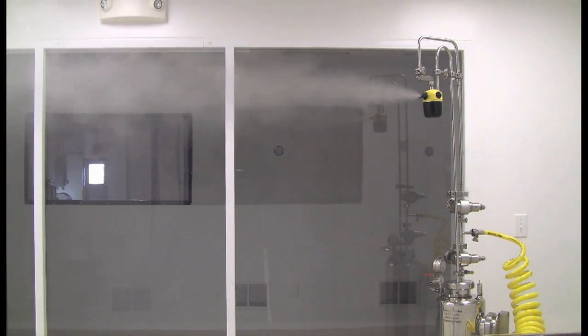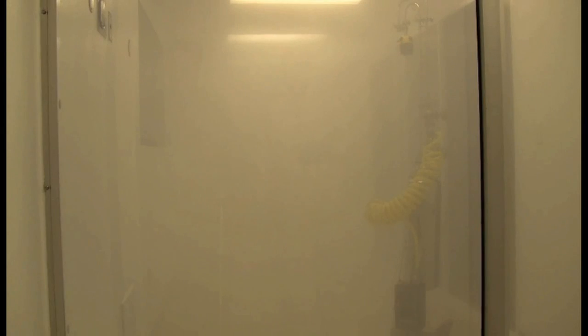We started our dry fog procedure after our room is completely prepped. It'll take 33 minutes to completely fog this clean room and then you've got to dispel the fog by turning on your HVAC system. And we're monitoring the relative humidity with our strategically placed sensors. We're just at the end of our dry fog procedure. We've dispersed all the fog in the clean room. We've waited for our allotted contact time.